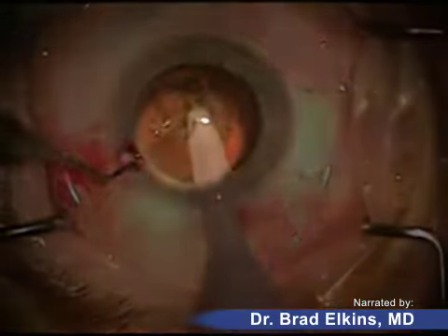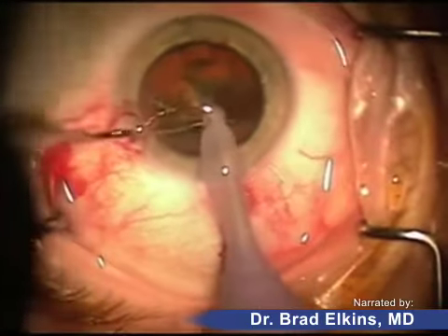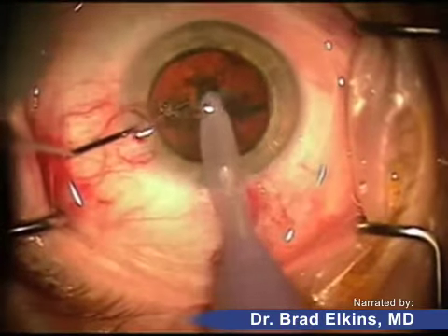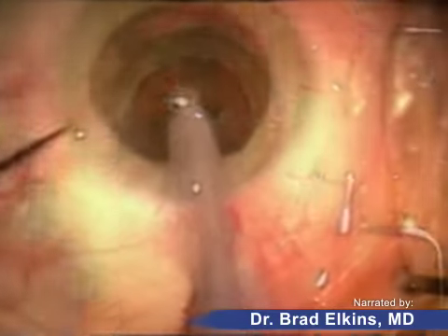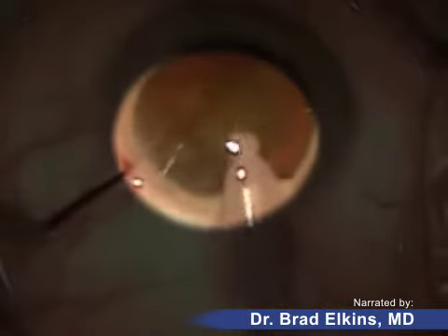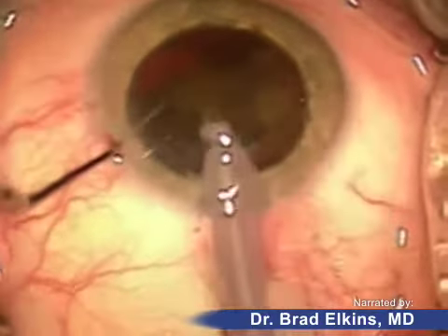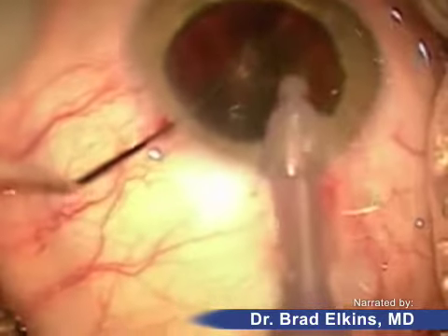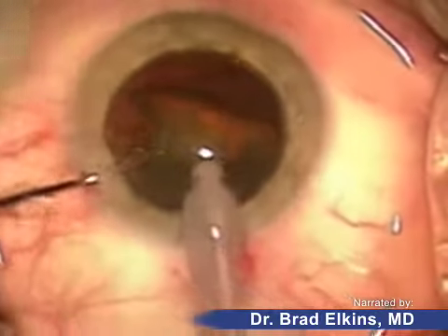As you can see, I'm making a little groove here and now the lens is going to be cracked in half. The lens is then rotated and we once again make these small grooves deeper and deeper, then it will be cracked into four different pieces. The lens fragments are freed and the instrument sucks out each quadrant, cracks them into small pieces, and vacuums them through the hollow needle tip so the fragments can be efficiently removed.